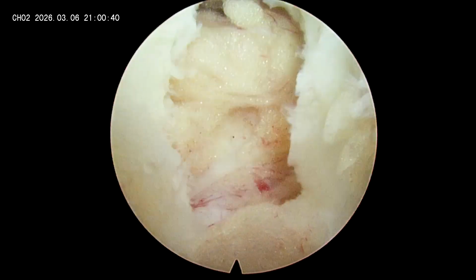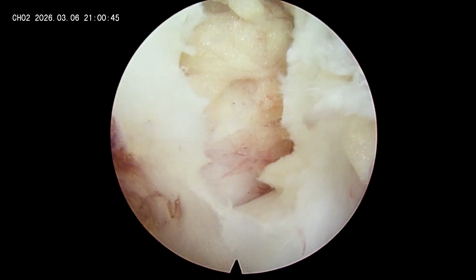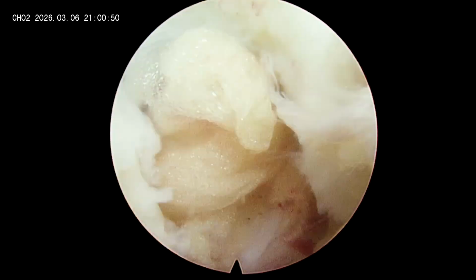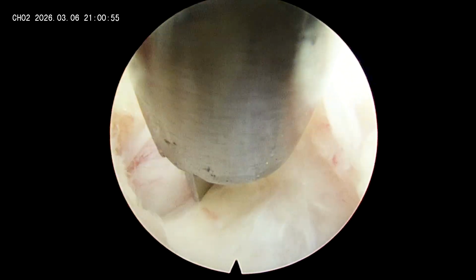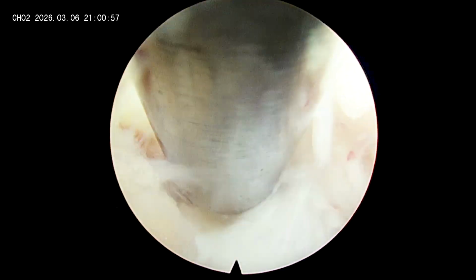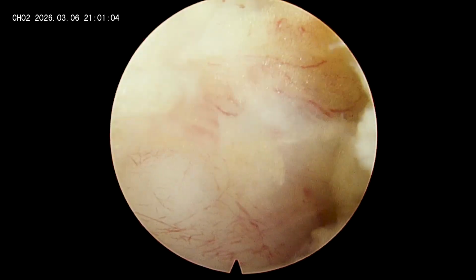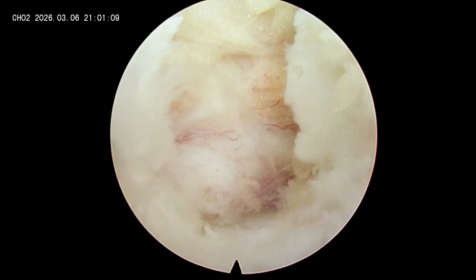So here you can see the structure which is lying immediately in front of me looks like a root, but again it is not confirmed. So try to remove the ligamentum flavum all around so that the traversing nerve root comes completely into vision. So bit by bit remove the ligamentum flavum, create this space lateral to the traversing nerve root.